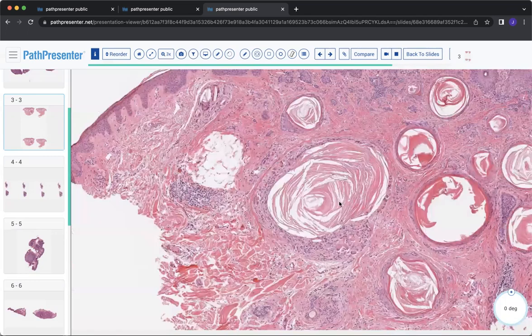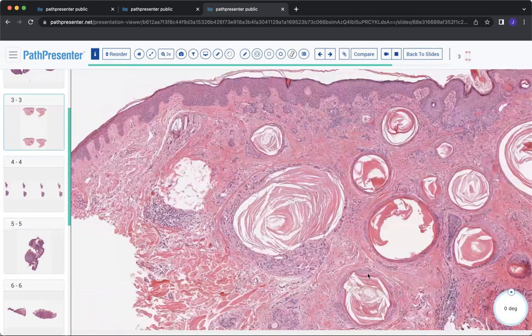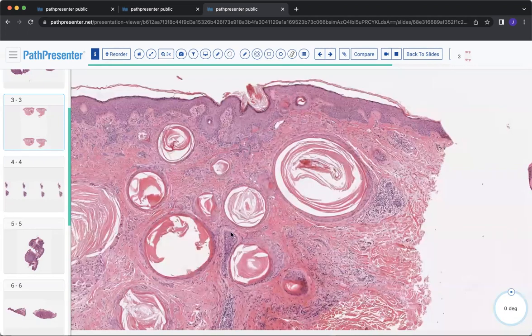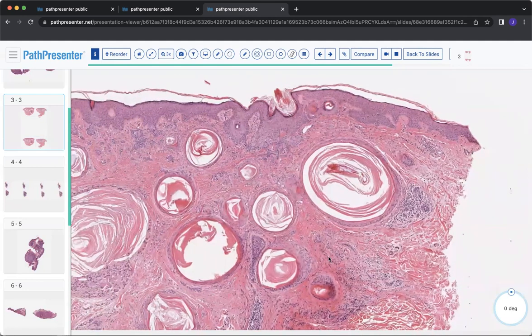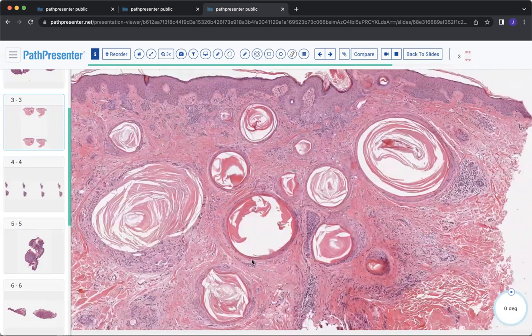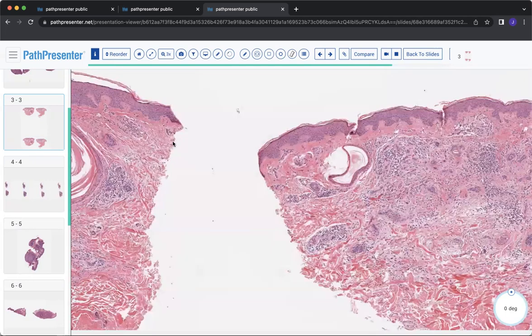So what is the name of the entity where you get many of these together clustering? It's in that tricho family again, but it's more towards the differentiated pole of things. So this is a trichoadenoma. Trichoadenomas are going to be defined as an adnexal tumor that's benign, but you've got these numerous cyst-like structures. And of course, adnexal tumors exist on a spectrum.